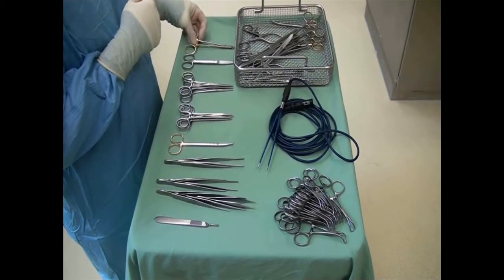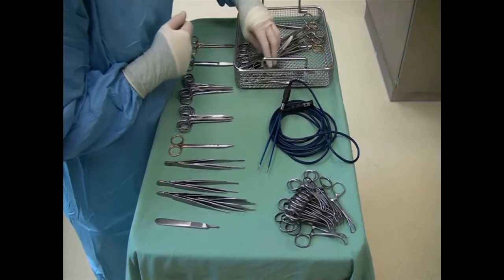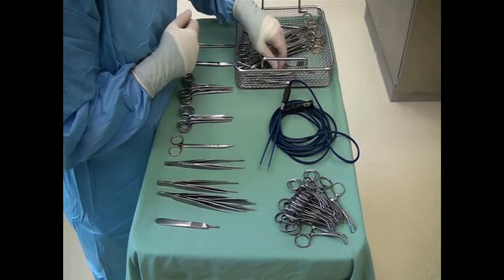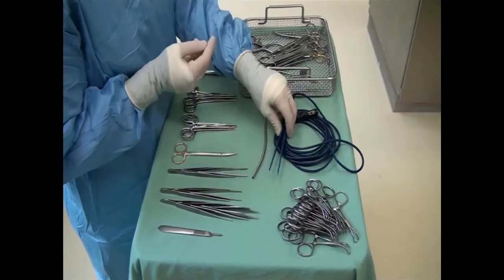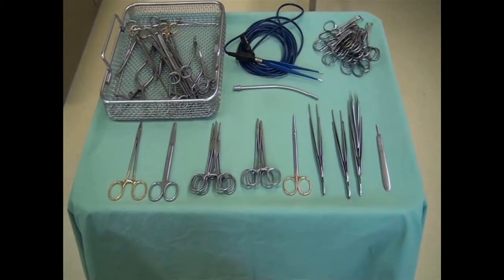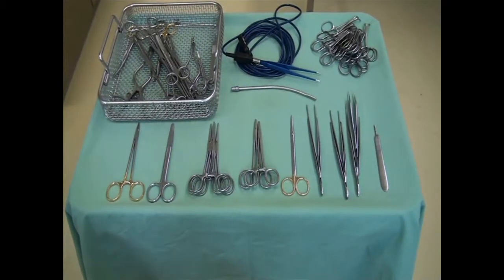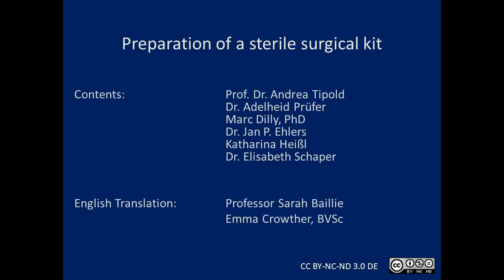Finally, suture scissors, needle holders and suction tubing are placed ready for use during surgery.